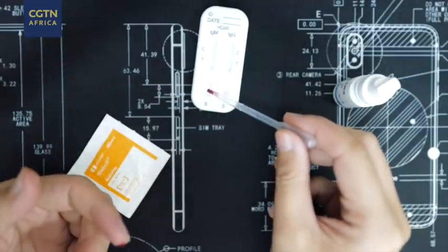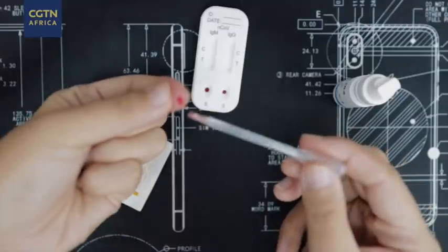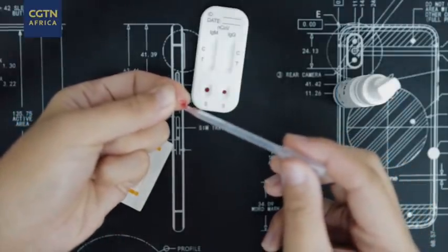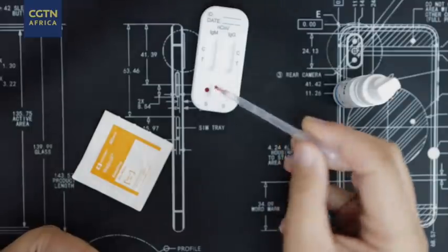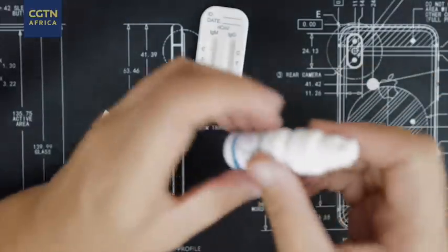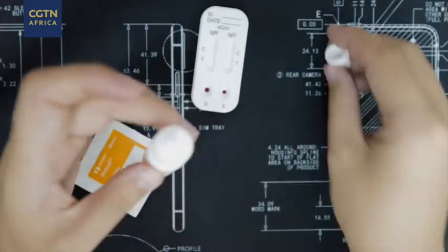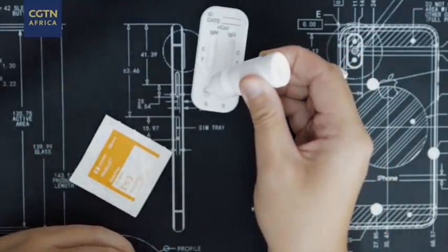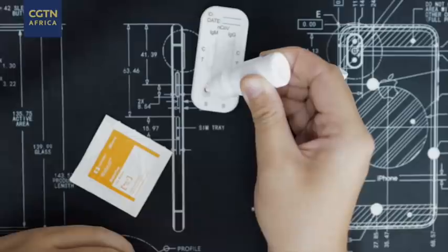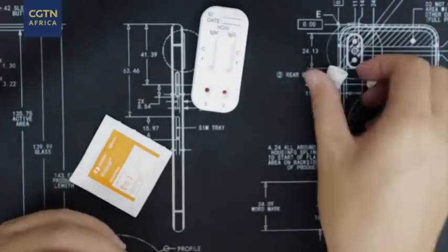With this one, I just drop it here. Just in case if I have more. Okay. And then from here, I'm going to use the diluent. I drop one drop, two drops. And then we just wait.